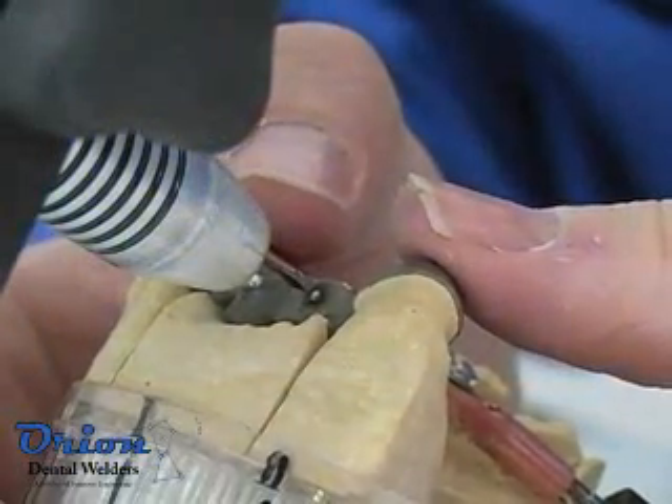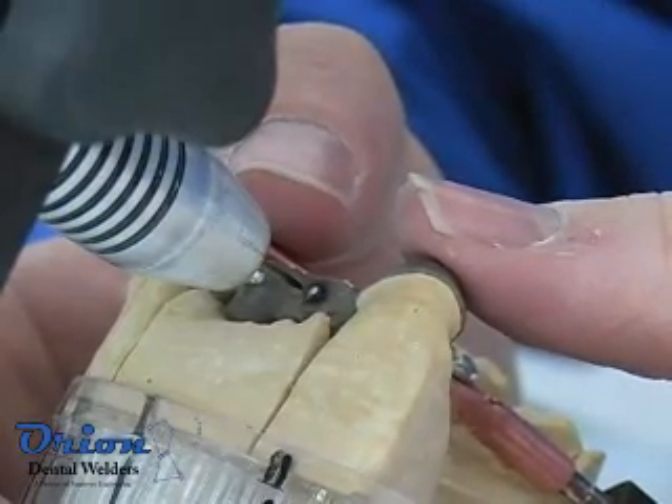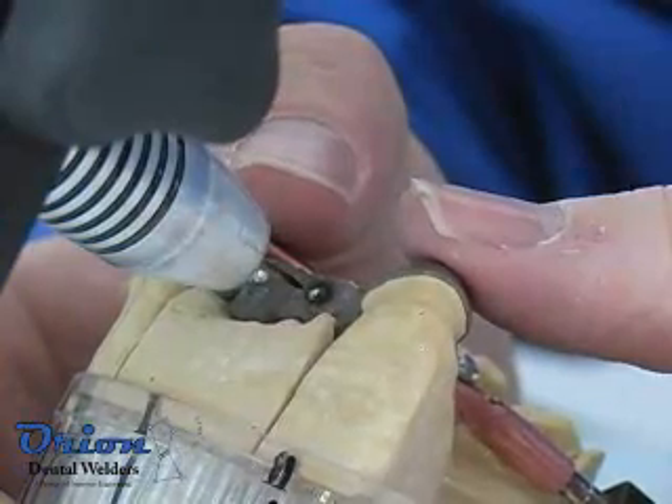The first weld will provide a long argon pulse to remove all oxygen from the lines. Subsequent welds will use much less shielding gas and will be accelerated by the Orion's computer.